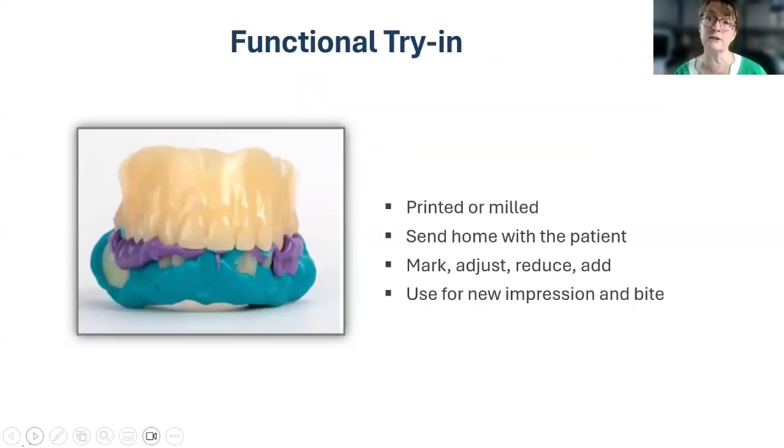And what could be next? So typically it is going to be some sort of a try-in. On occasion, we can go directly to finish, but I don't necessarily recommend that. I prefer a printed try-in.